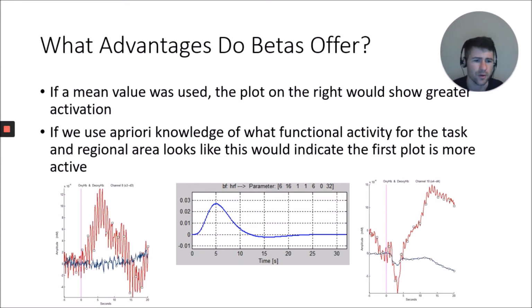So the one on the right, I would assume is more ambient brain activity, brain activity that had nothing to do with the task since it took so long to respond. It could be peripheral information. It could be just the brain wandering. It could be a lack of focus or something that caused a later delay. The other thing worth noting is this looks to be even a little bit of noise here, and I say that because both the deoxy and oxy move in the same direction at that moment.